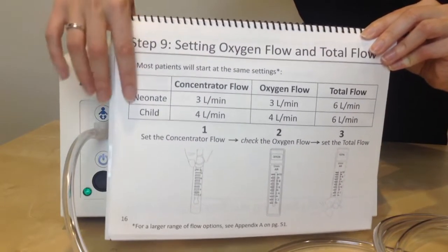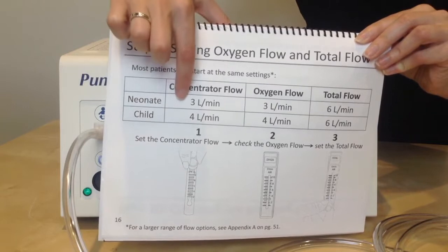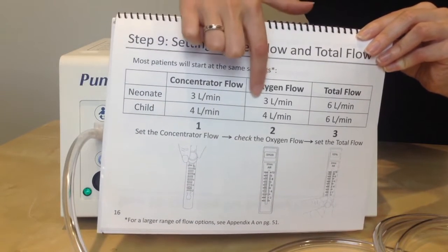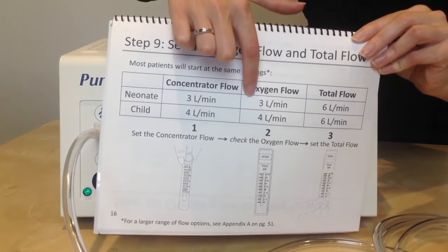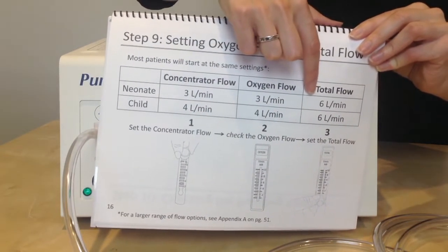For our neonatal patient, we're going to set the concentrator to three liters per minute, confirm that the oxygen flow is three liters per minute, and then set the total flow to six liters per minute.